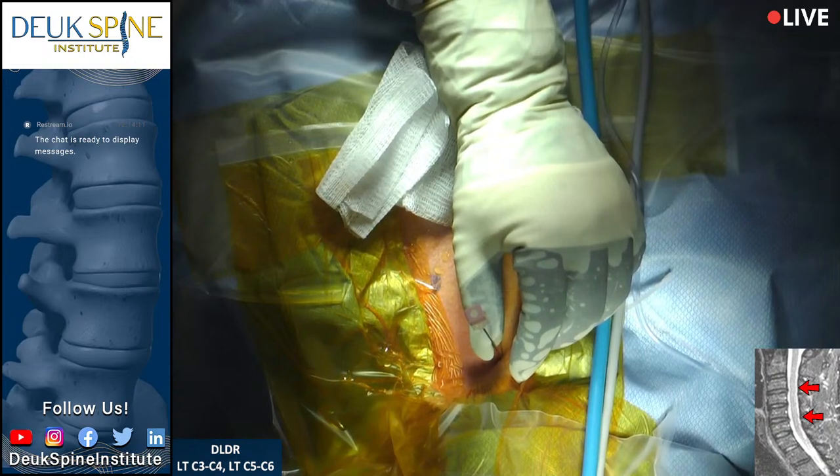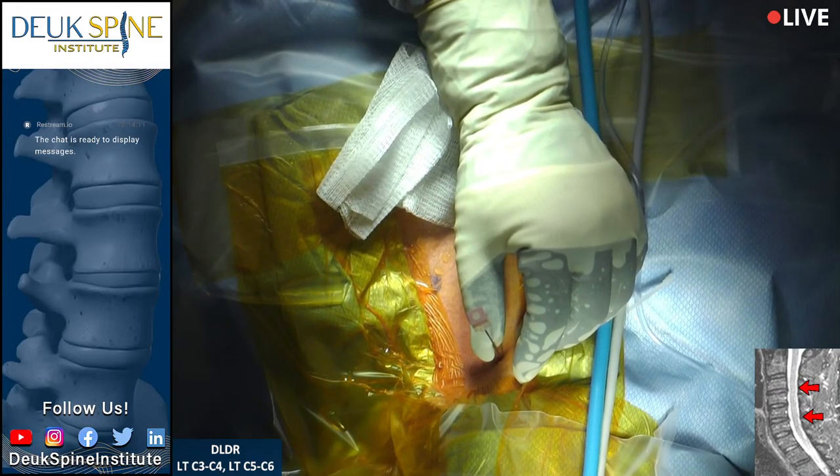Two discs are herniated — small herniations at C3-4 and C5-6. Our patient comes to us from Nicaragua; he's a surfer who has suffered with neck pain for some time. We've just placed the first needle at C3-4.